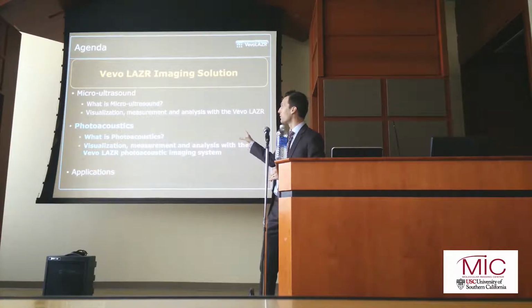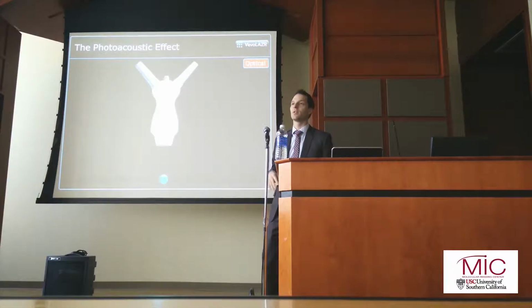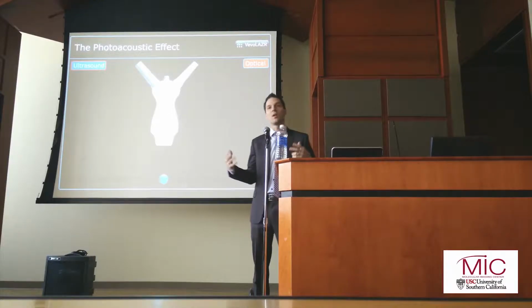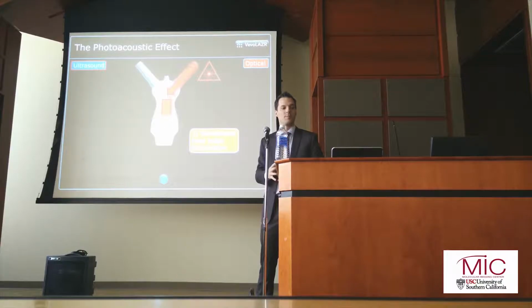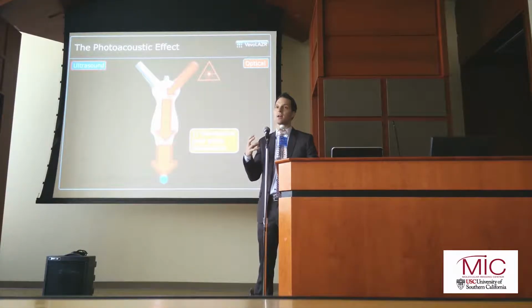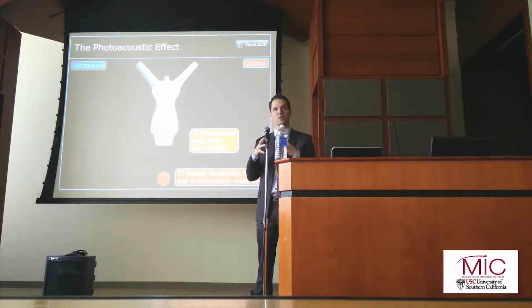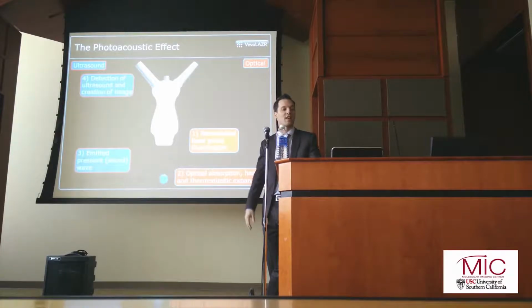I'm now going to move into the photoacoustics portion of the talk. So what is it, first of all? Photoacoustics is really a hybrid optical ultrasound imaging modality. What does that mean, really? We use a pulsed laser light to illuminate a tissue. Anything in that tissue that absorbs that light gives a thermoelastic expansion, which results in a pressure wave which travels through the tissue. That pressure wave is essentially an ultrasound wave, and we can detect that ultrasound wave with our transducer. So that's the long version.